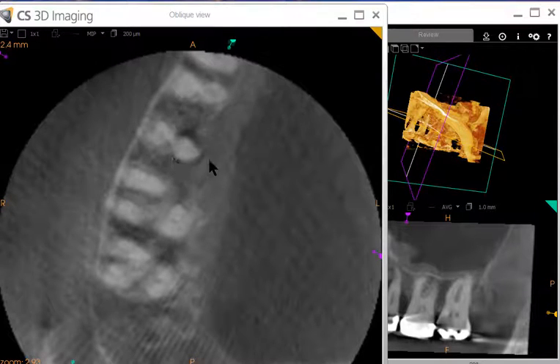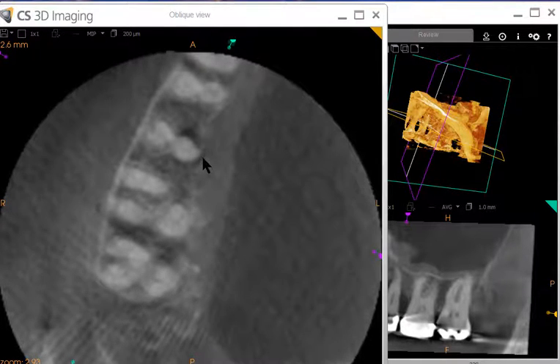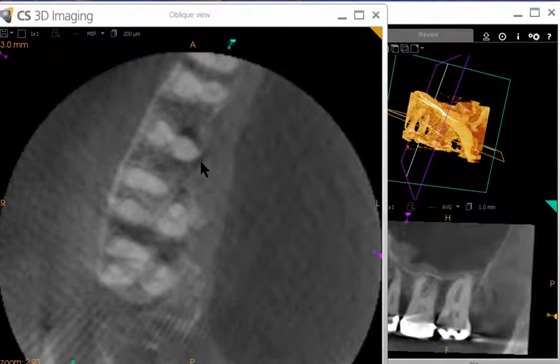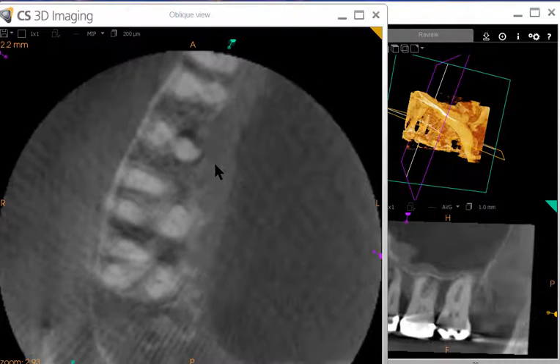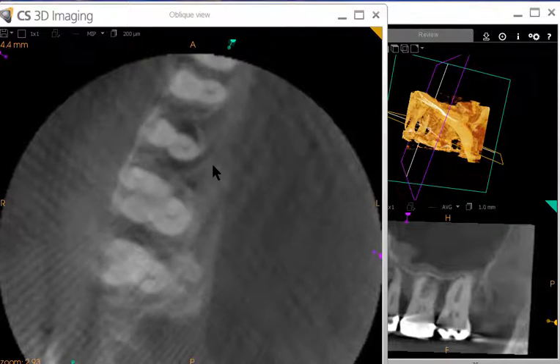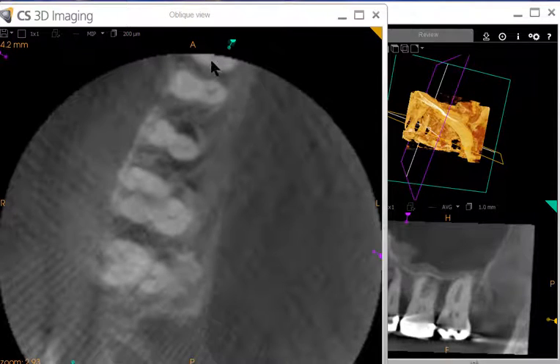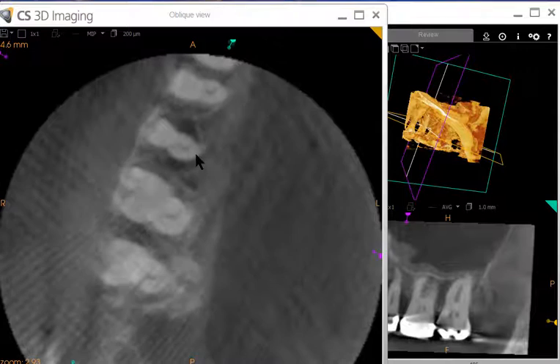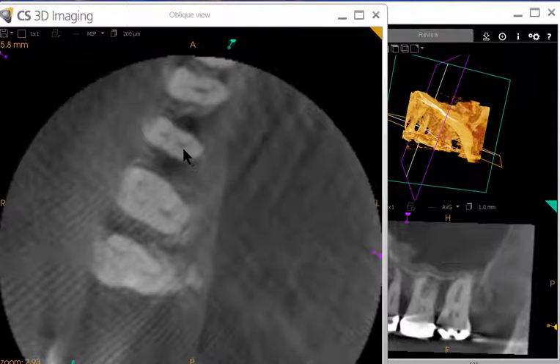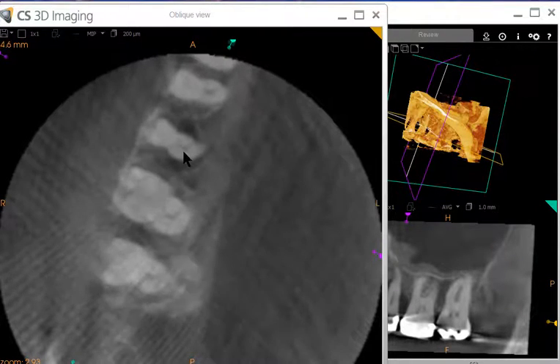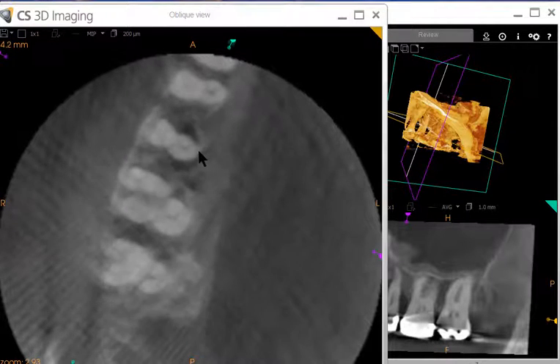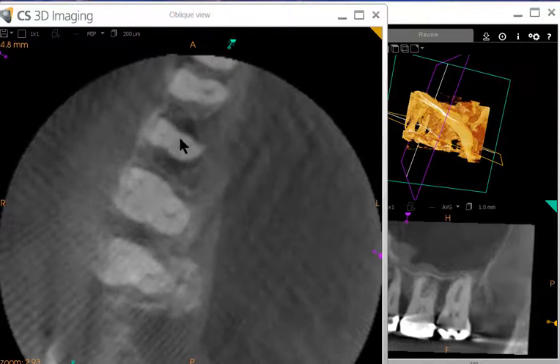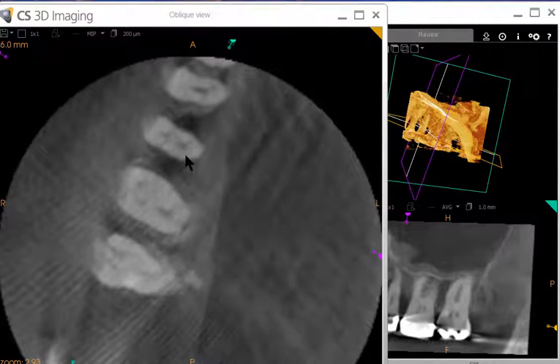You can notice there's bone loss all the way around the outside of the root. Because of the Nyquist theorem, you can't detect an object more than twice the width of the minimum voxel size — that would be 400 microns, or about the width of a size 40 root canal file. Most cracks are smaller than that. If we had taken this scan at 76 microns, it's possible we could have visualized the crack — that's about the width of the tip of a number 15 root canal file.